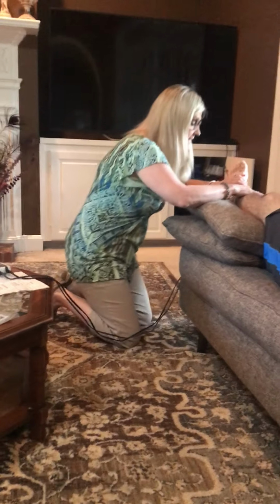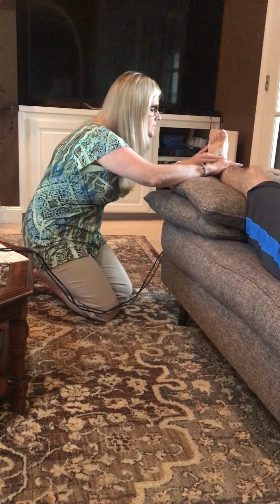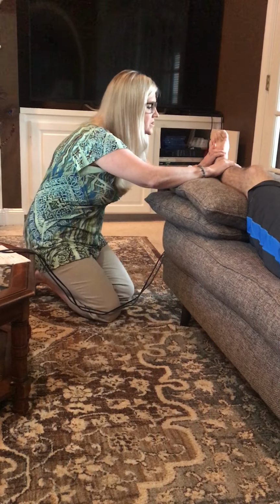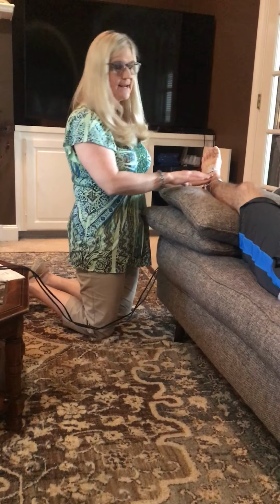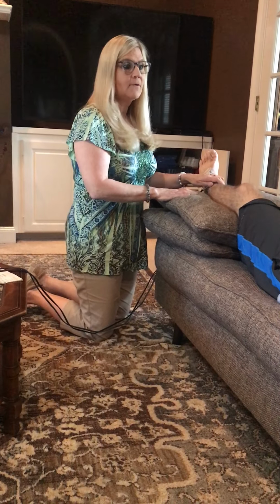I'm actually going to check the area, check to make sure there's no redness around their electrodes or any type of adverse reaction, that I've got good contact, and that everything is still working well for him. Okay? All right.